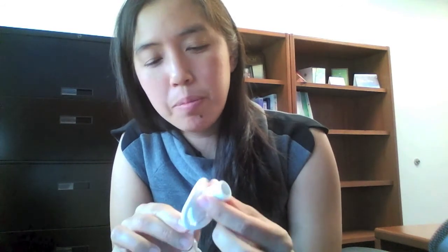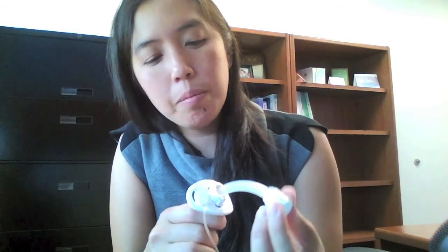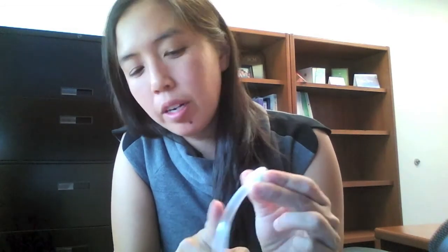Okay. And then once you get the trach in, you take out the obturator and you place this inner cannula into the trach, into the outer cannula, and lock it in place. These dual cannula trachs with an inner and outer cannula make it a lot easier for the patients to clean, because all these trachs tend to get full of mucus and debris. They just unlock it, pull it out, and they can use a pipe cleaner to clean it out or use a disposable inner cannula to put a fresh one in.